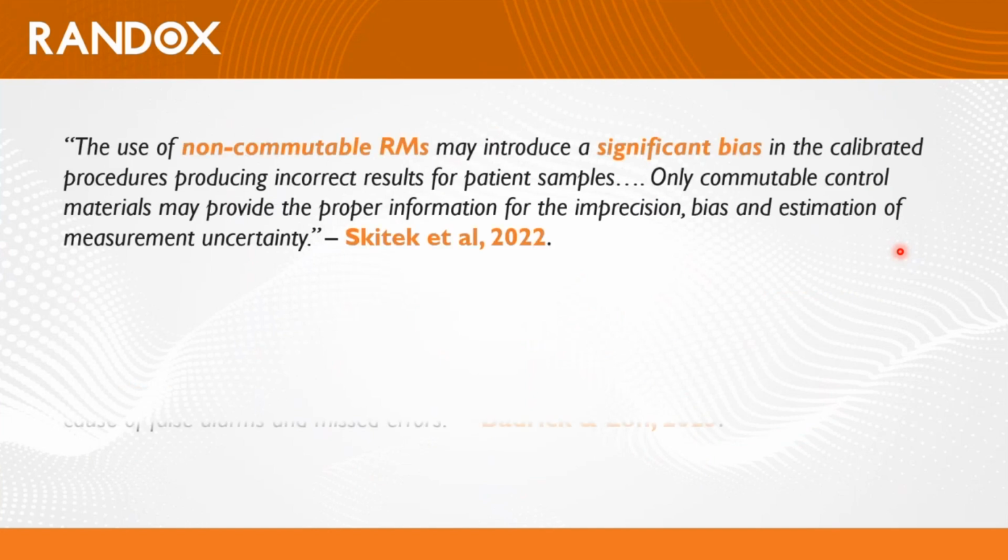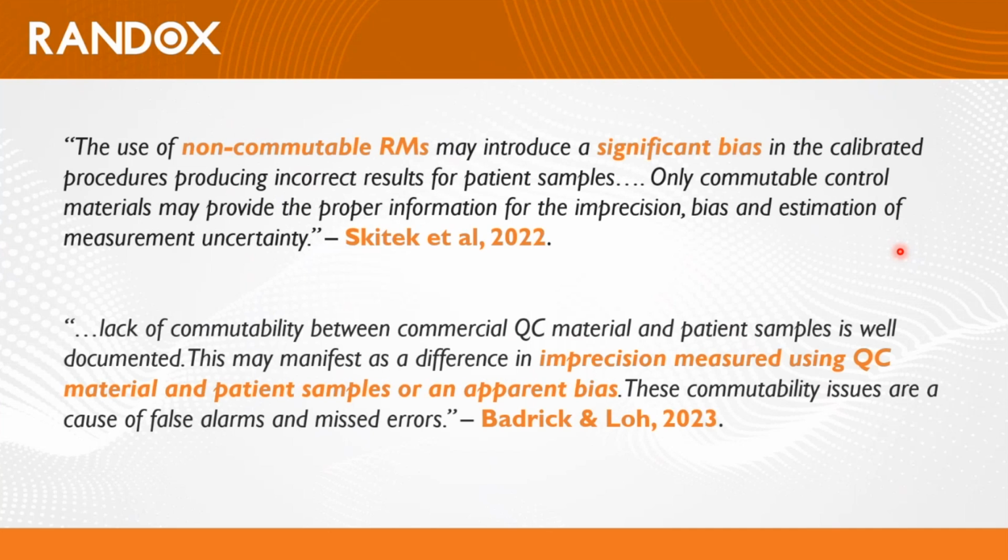Now, there are studies that have been done on commutability of QC. And if you want, I can send you these studies. You can ask me. You can see these 2 studies have been released in the last 3 years, 2022 and 2023.